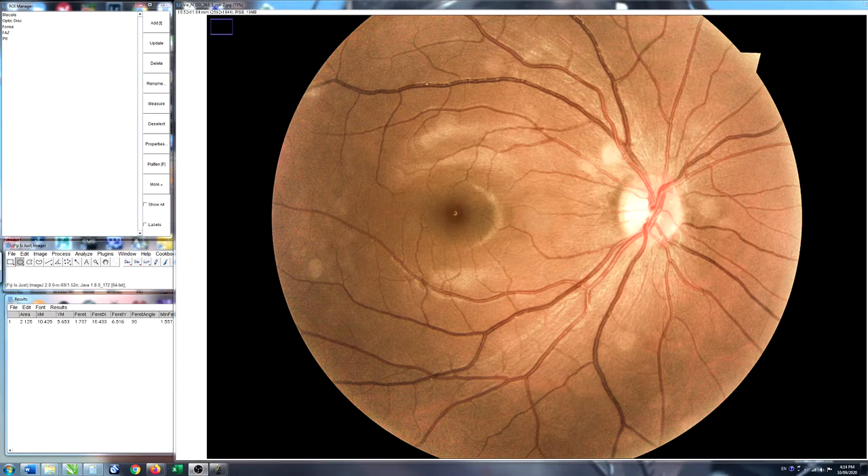Now we've opened up one of the pictures — this is the right eye we took just then. These structures are relatively common. If you look up optic disc, fovea, fundus photography, there are hundreds of pictures like this on the internet where you can see the main structures labeled really easily.